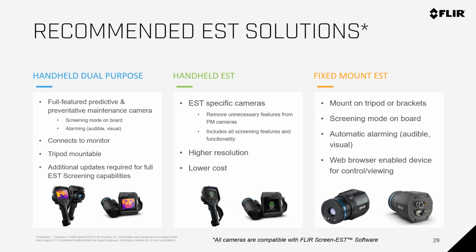You can adjust the volume, and you can turn it up pretty loud so that you can hear it from a good distance. So there is alarming. But there's still usually a good value to have a person there, call them an operator, if you will, because somebody could screen themselves without somebody monitoring, right? Somebody screens themselves, they set off the alarm, they say, well, screw it, I'm going into work anyways, or screw it, I'm going to go into this restaurant anyways, right?